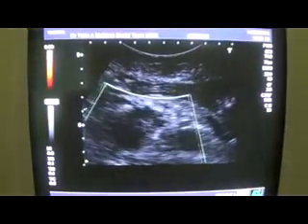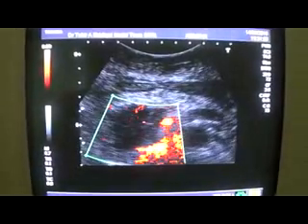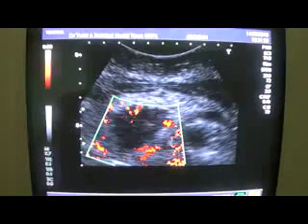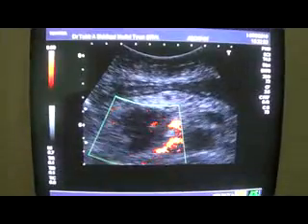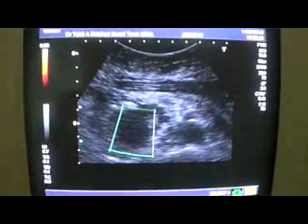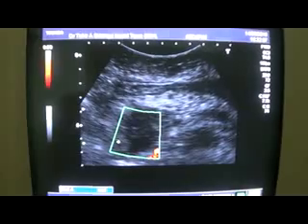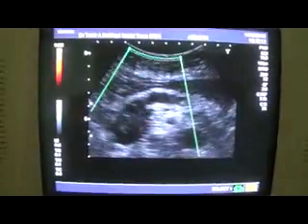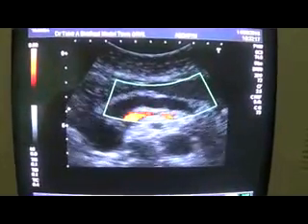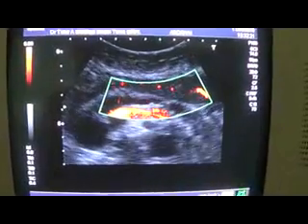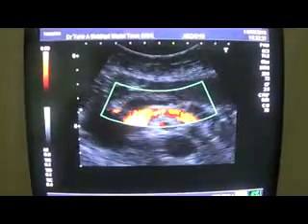Here is the mass and it does not show any significant vascularity on color Doppler. Now this tubular structure — whether it is a vessel or a duct — if it is a duct, it will not show any blood supply.